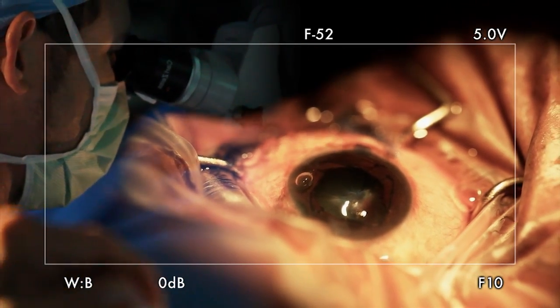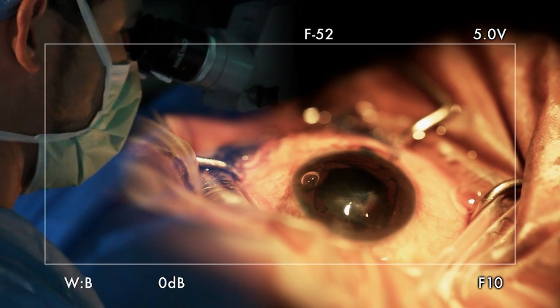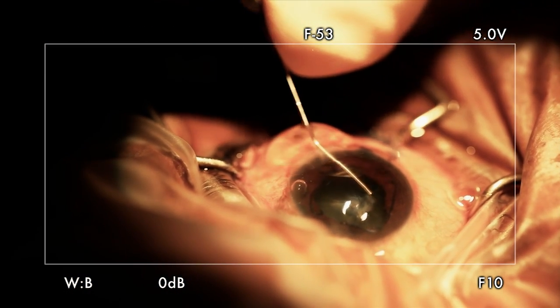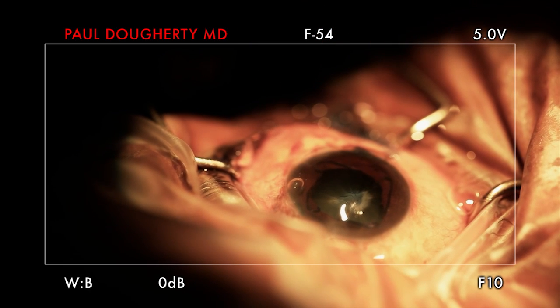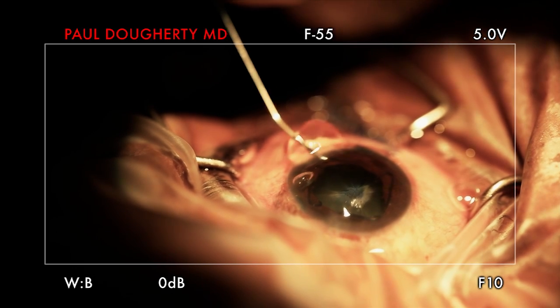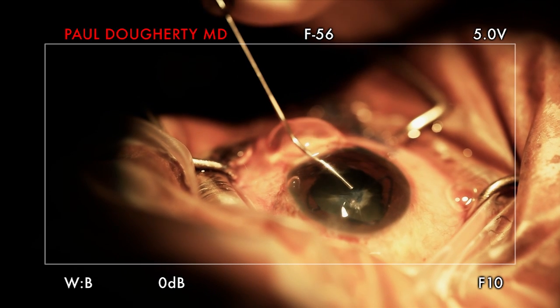I just put in a little more Lido now. I need a disco-elastic. There's so much iris crud there that I can't see anything. And this is trash. Need more? Voila. Thank you. That was quick. You just knew it was going to be a tougher case.